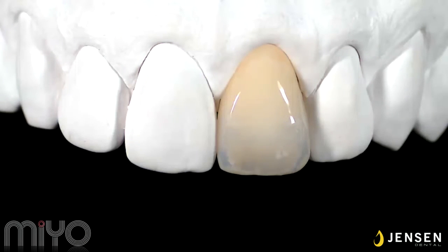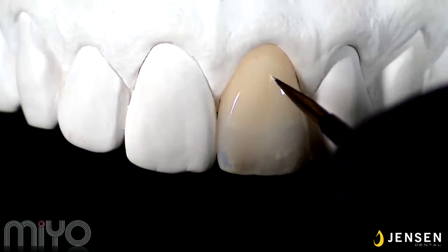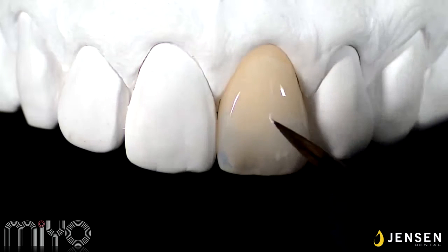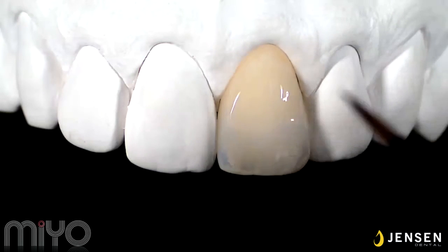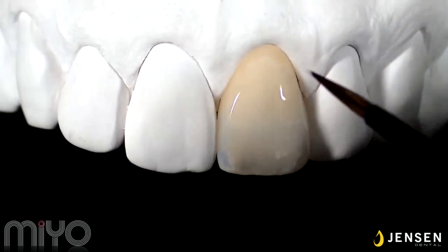Let's make sure that the entire surface is covered with the glaze medium, either MiYO or glaze paste. Then we fire. For added depth and translucency, we also have the option to use the hybrid technique, which is the spray glaze.